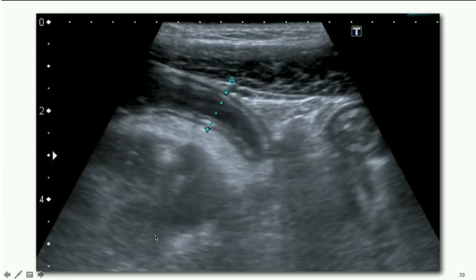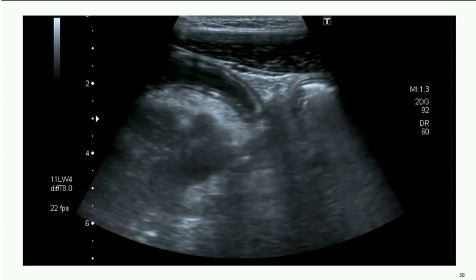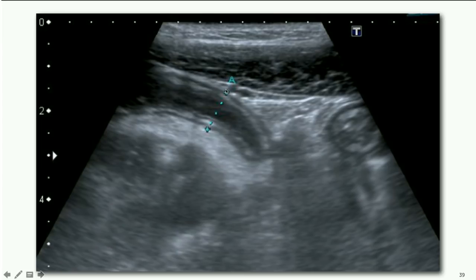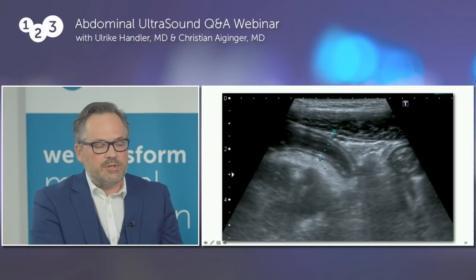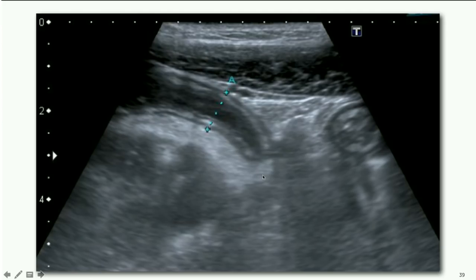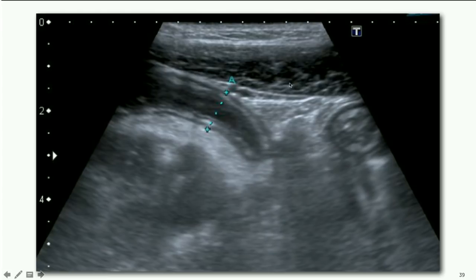Here you can see this tubular structure which is more than six millimeters in diameter, with a swollen wall of the appendix. The sonographic palpation is positive — there is pain during compression of the appendix. You can also see hyperechoic regions surrounding the appendix: this is the fatty tissue reaction of inflammation, which has already exceeded the appendix and involves the surrounding adjacent structures.